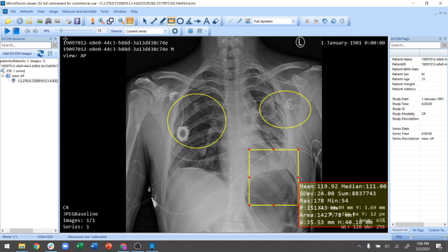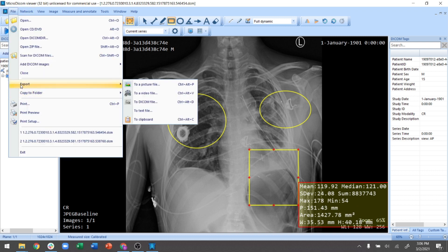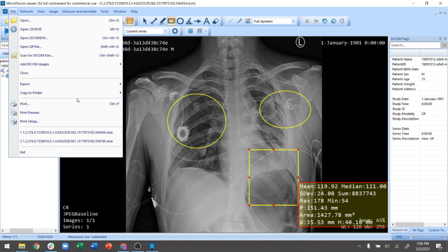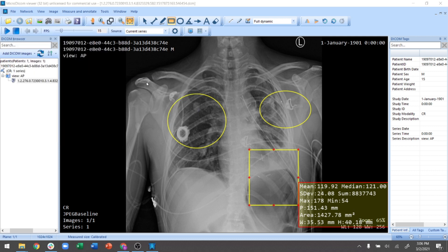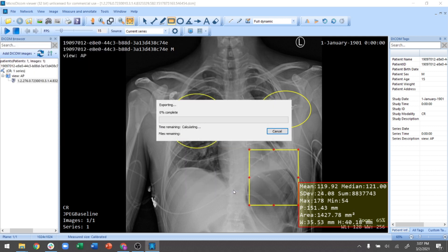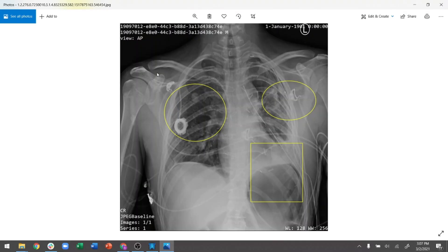Once you're done annotating, the next task is simply to export. I go to export to file and say export — and it exported. Right next to the DICOM image you can now see the annotated image.